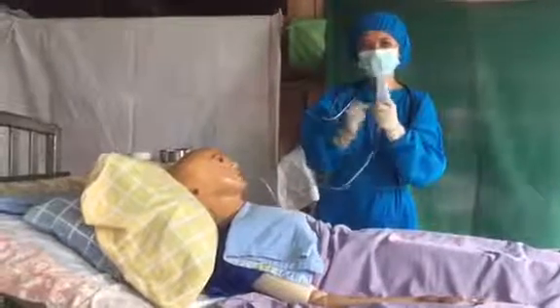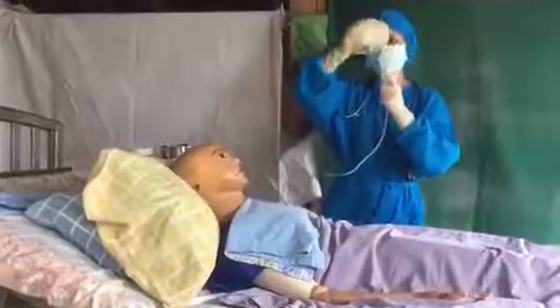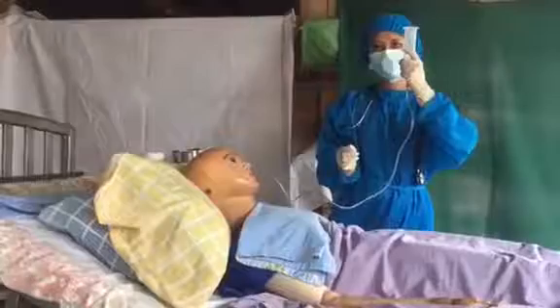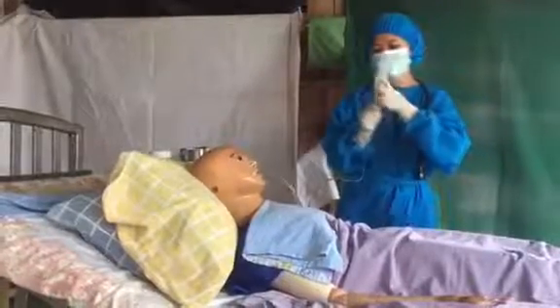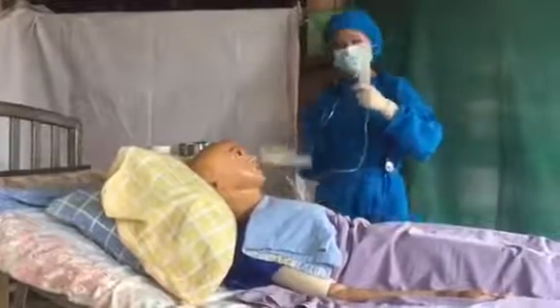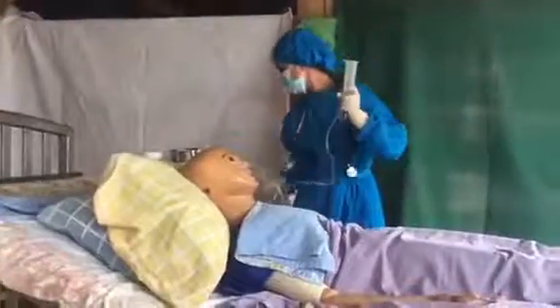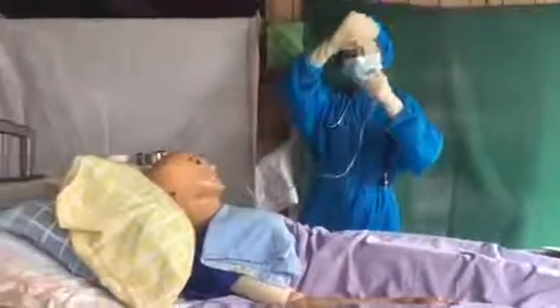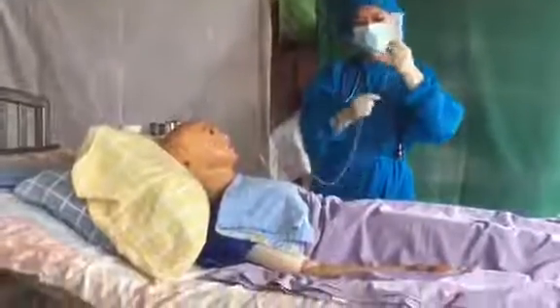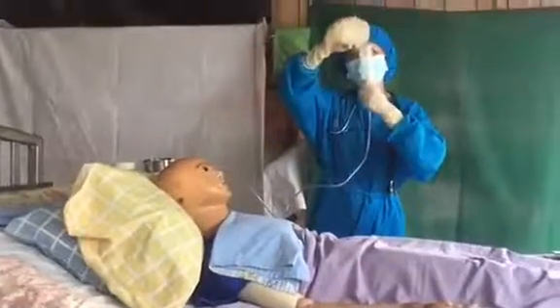Kink or lock the tube and introduce Ensure 60 cc and let it down. Then lock it again and introduce another 60 cc of Ensure. So introduce another 60 cc of PNSS or the normal saline. Then let it flow. Lock the tube and introduce 30 cc of medication.